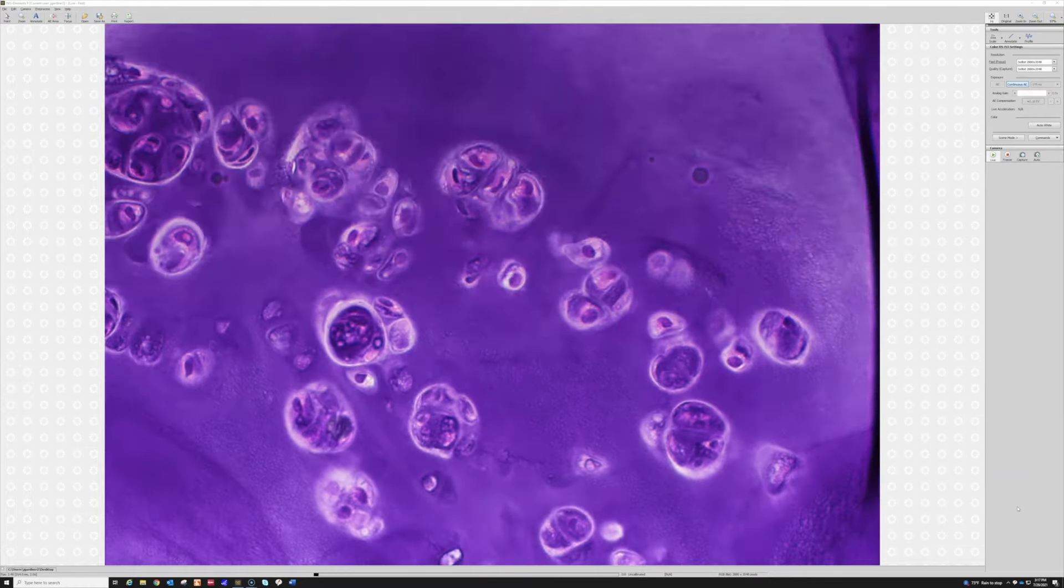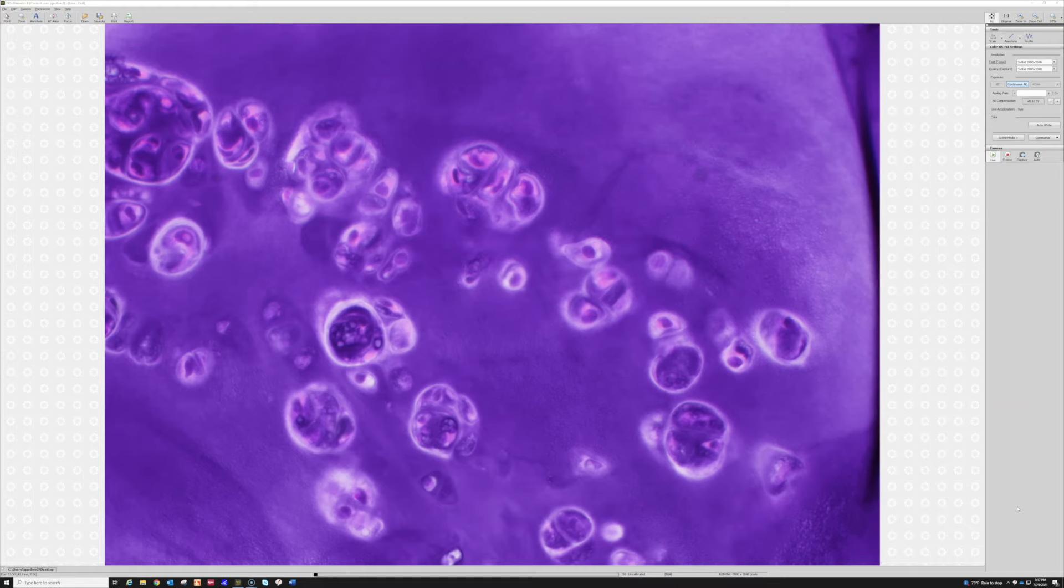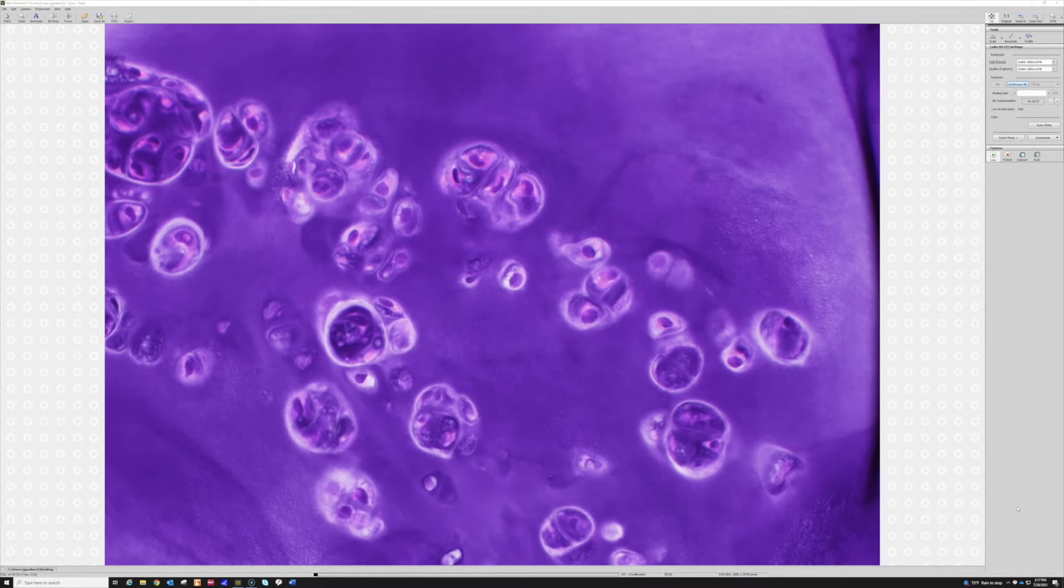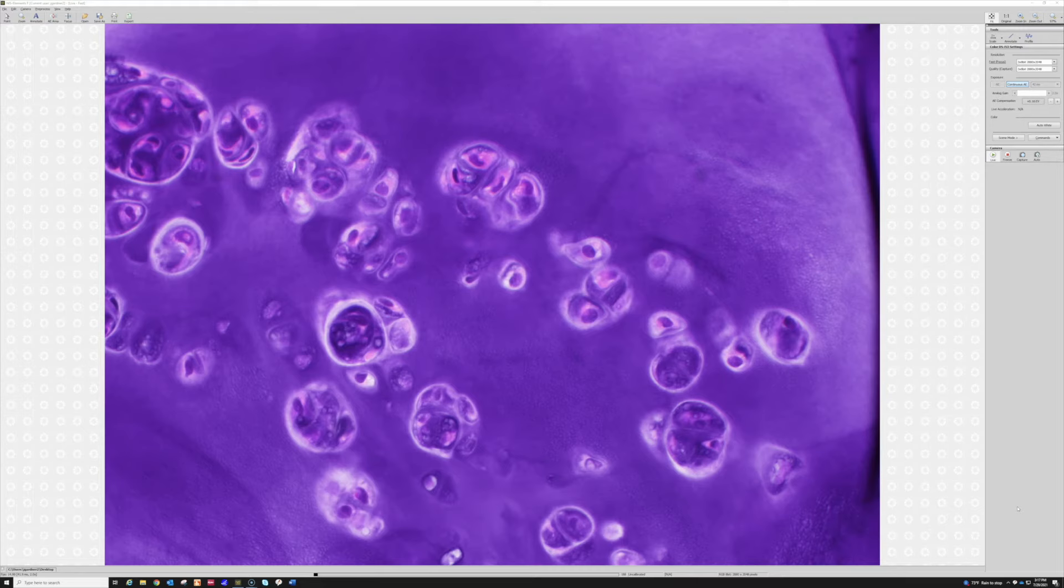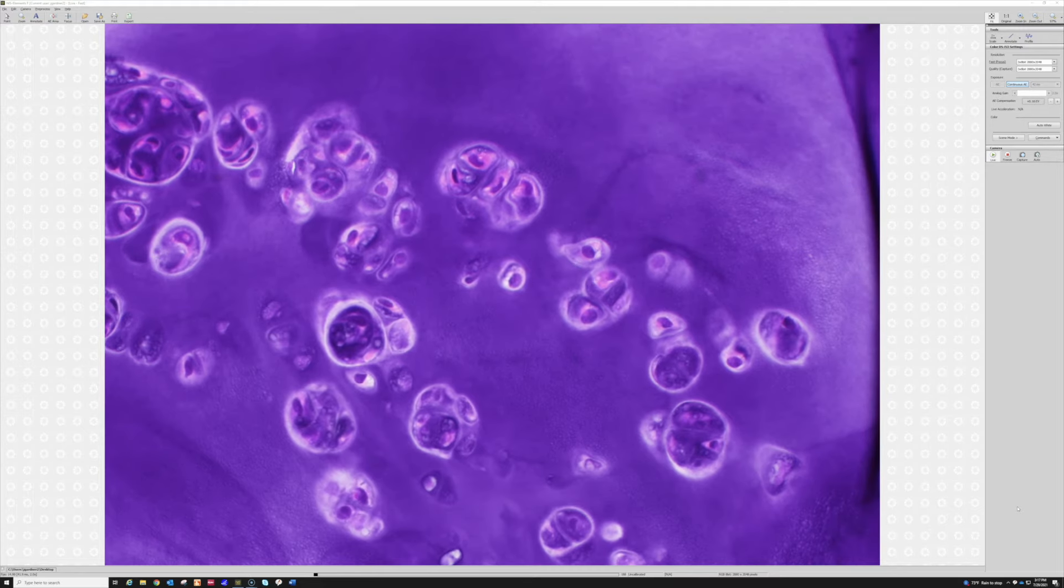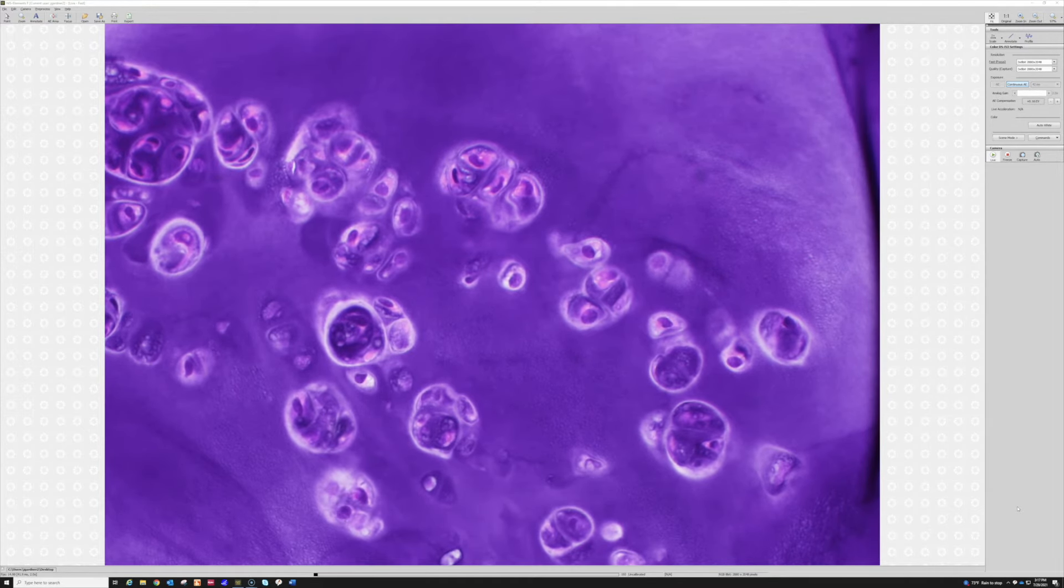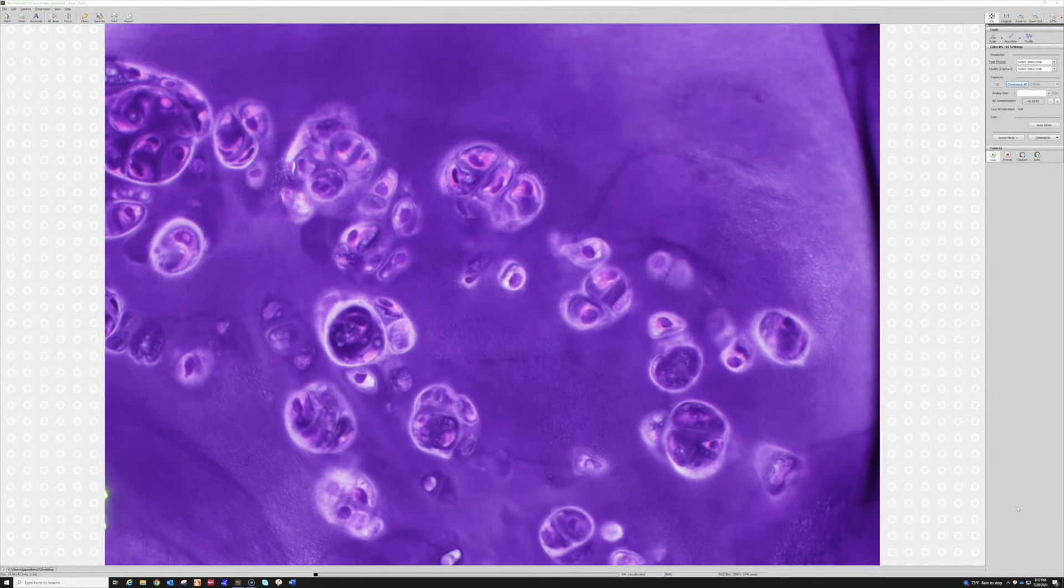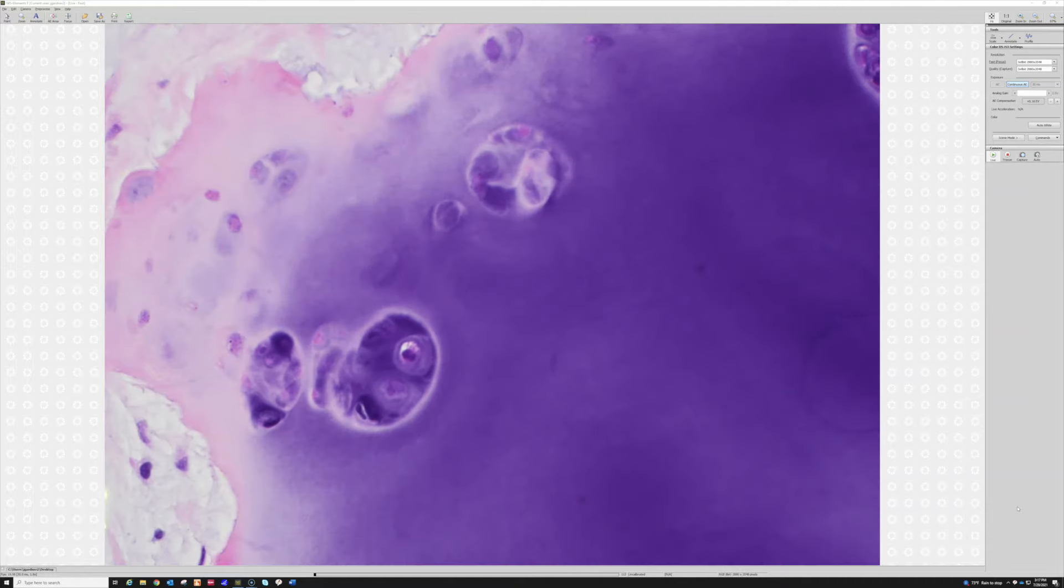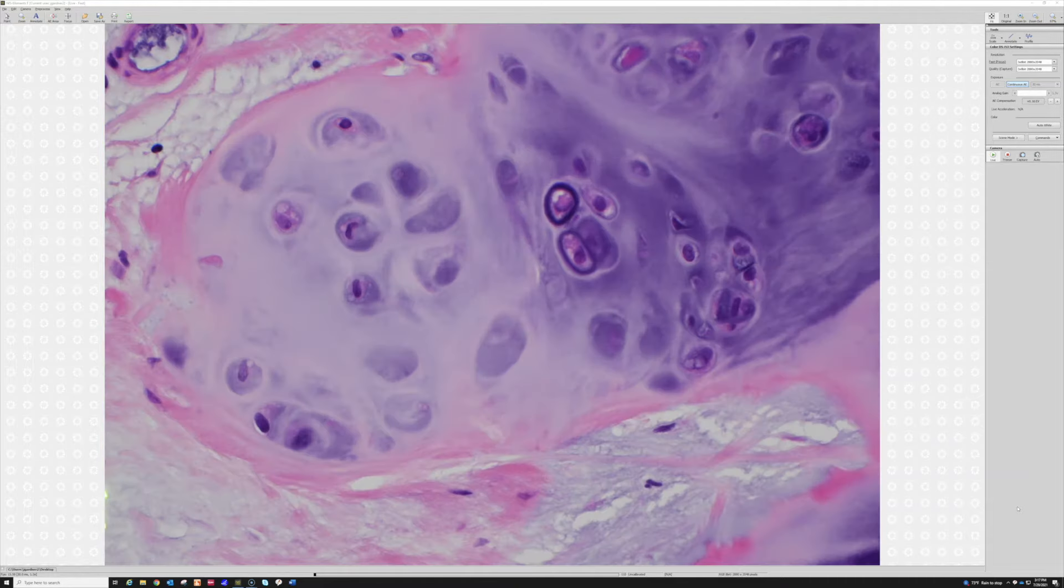But I'll try to get it in focus here. Sometimes chondrocytes, their nucleus turns into like a little dark purple dot and you can't even see the nuclear features at all. But here we can see them - they've got little tiny round or maybe some occasionally bean-shaped little bland nuclei sitting in those little lacunar spaces. Pretty awesome to be able to look at up close here.